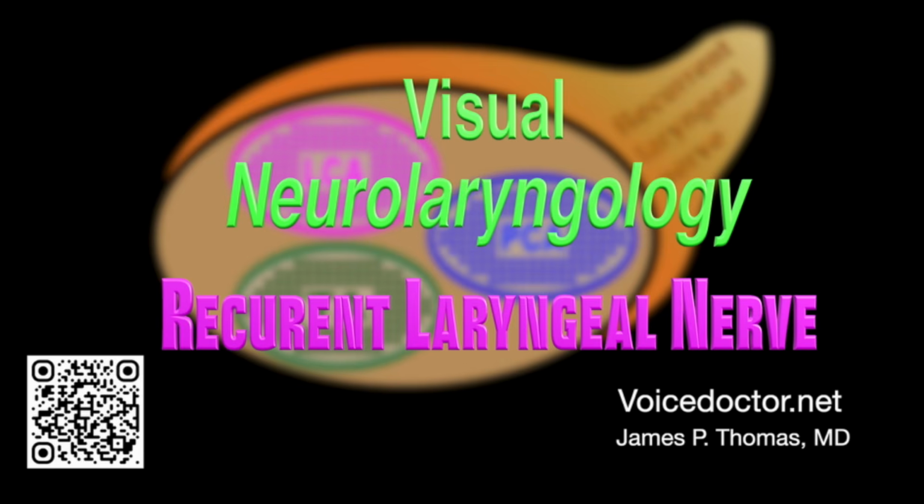I'd like to go over the topic of neurolaryngology, which is an incredibly broad topic. I'm going to introduce it by focusing on one nerve and one muscle, with the proposition that visual neurolaryngology, that is, looking carefully with an endoscope, can be as accurate as EMG diagnosis of what's going on in the larynx. Whether you choose one or the other just depends on your equipment and your familiarity with each. But let me share with you what I do with visual neurolaryngology.